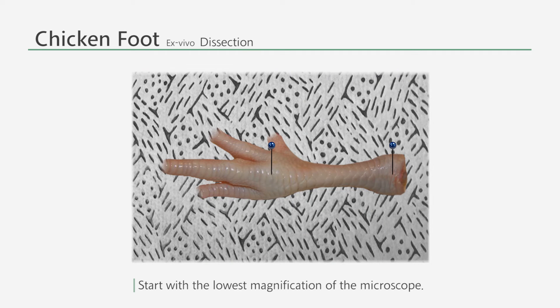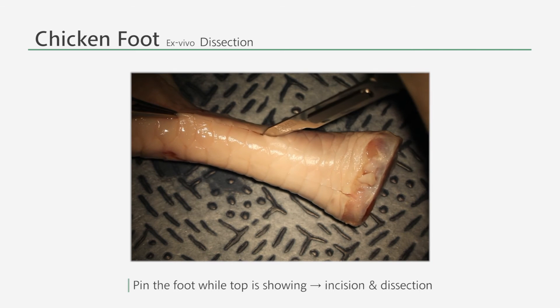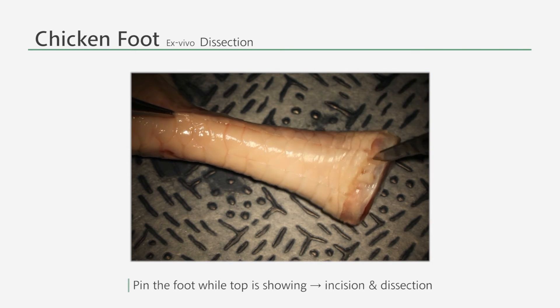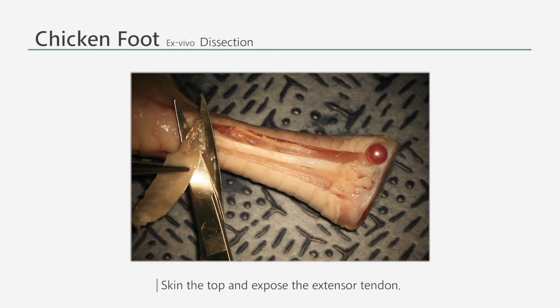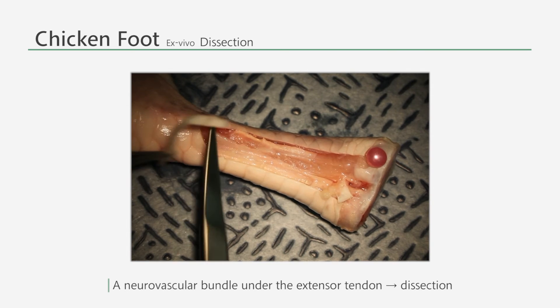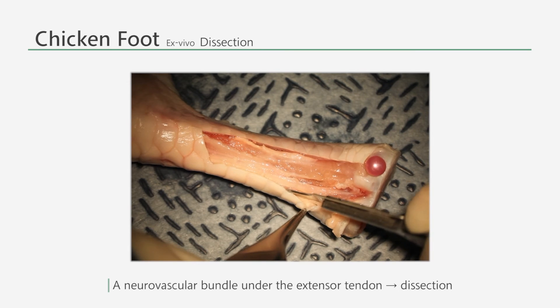For the third training, which is with chicken feet, it is most convenient to start from the lowest magnification of the microscope. Pin the foot on the board so that the top of the foot is showing and make an incision. Use the forceps, a knife, and the iris scissors to skin the top of the foot and expose the extensor tendon. If you lift the extensor tendon, you will be able to find the neurovascular bundle underneath.